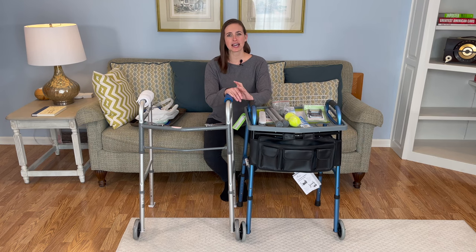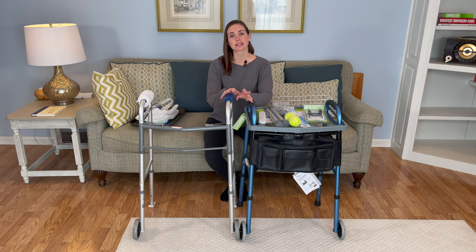Hi everyone, it's me, Lindsay, again with EquipMeOT, here today to talk about walkers — and more specifically, I'm going to be talking about walker accessories.